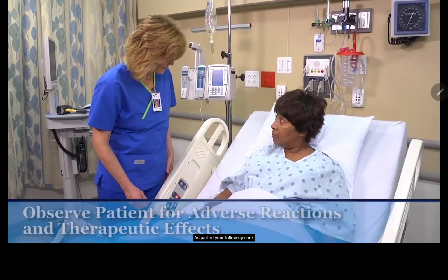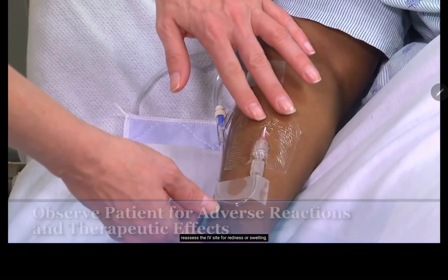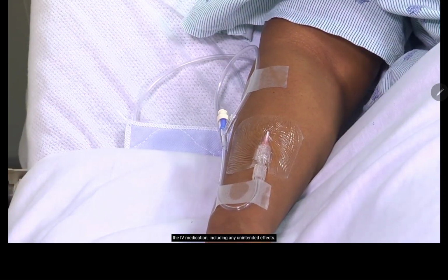As part of your follow-up care, reassess the IV site for redness or swelling. Evaluate the patient's therapeutic response to the IV medication, including any unintended effects.